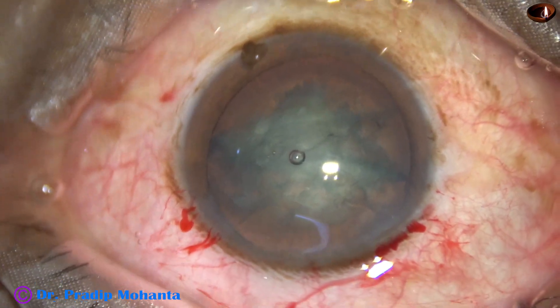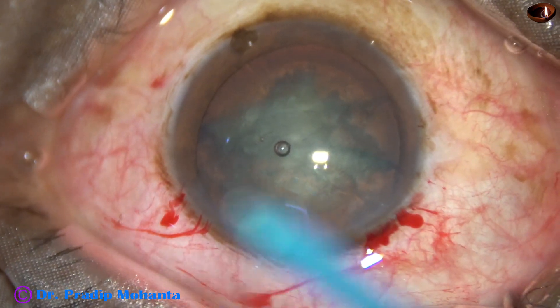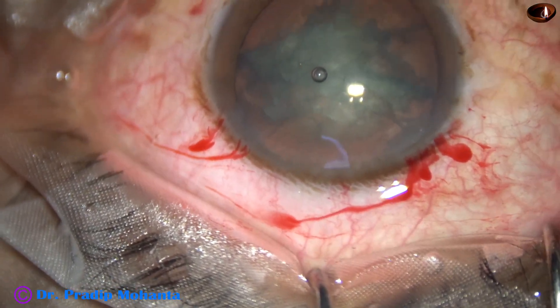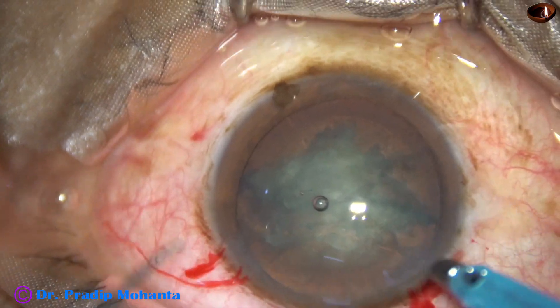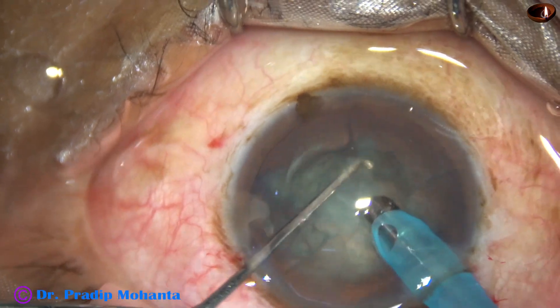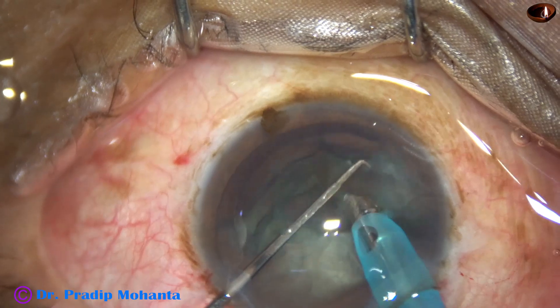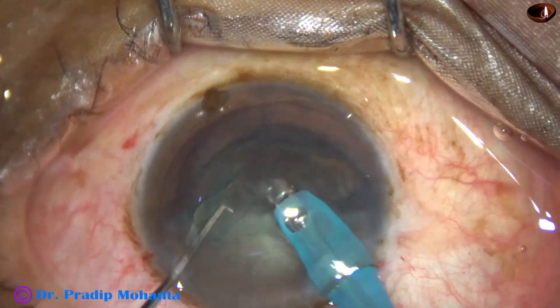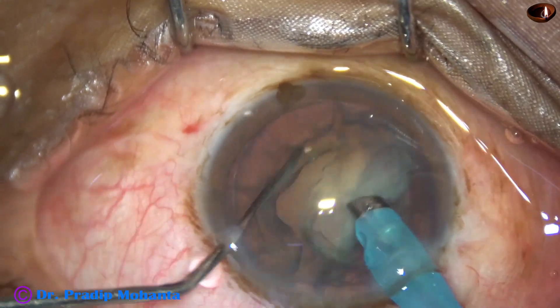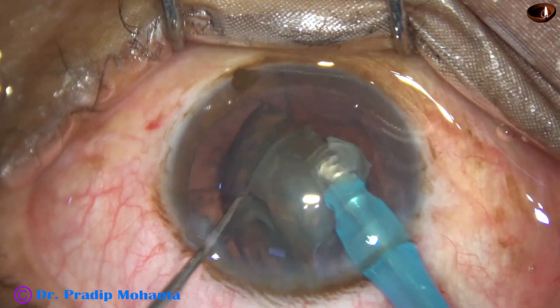Some more OVD is added. Now it is time to introduce the phaco needle. The phaco needle goes into the anterior chamber with its bevel down. Some superficial lens matter is removed, and then I work on each hemi-nucleus to emulsify it, rotating to the other hemi-nucleus, dividing it into 2 pieces and emulsifying.